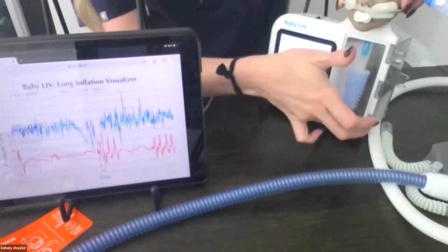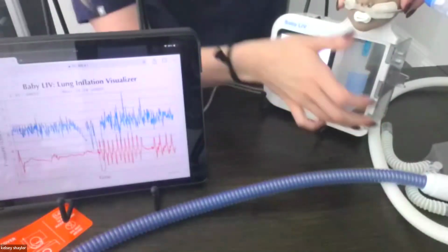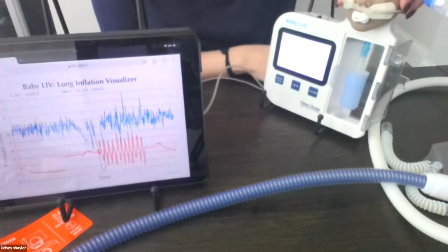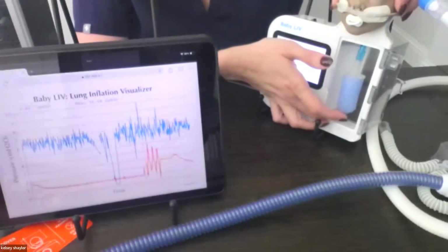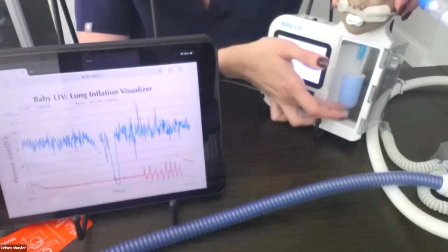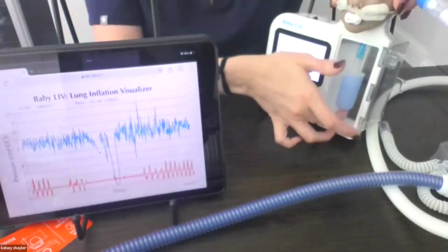So I'm going to do this a little bit longer so I can save the line for you. But I do want to show, even when properly fitting, if I were to turn this down, not up. So if I turn this down to, let's say 3, which I know a lot of people, this is where we get comfortable with high flow in the NICU. Maybe we get a little bit nervous about flow because again, we don't know what that pressure is and we're very comfortable with CPAP. You can see how much less pressure we're delivering and how, depending again on how hard that baby is working, we're probably going to hit 0 or go into negative pressure, right, on inspiration. Every time with those breaths, which is what we want to avoid.